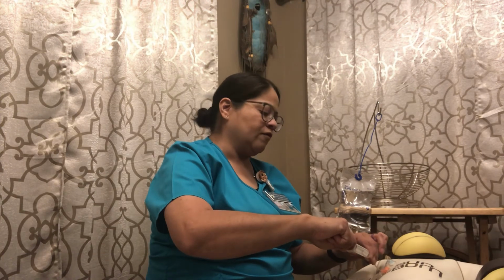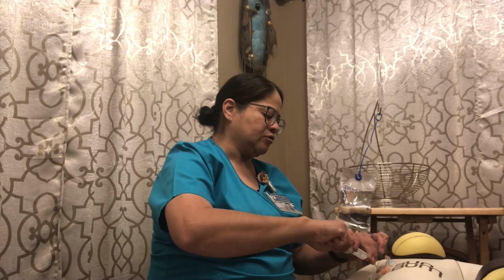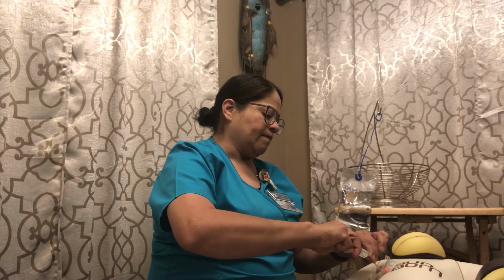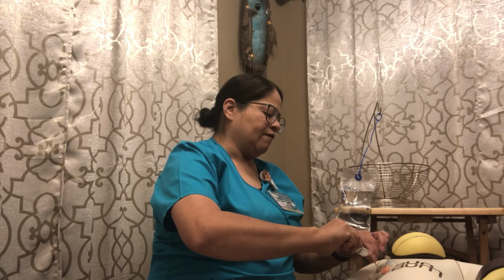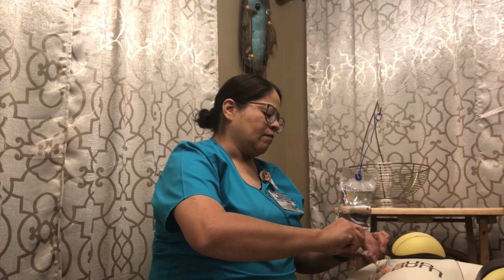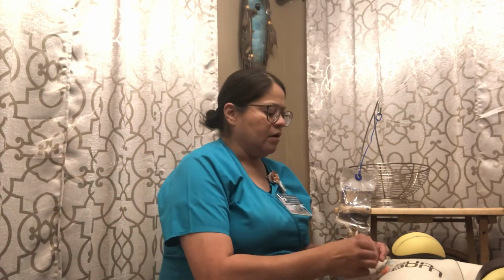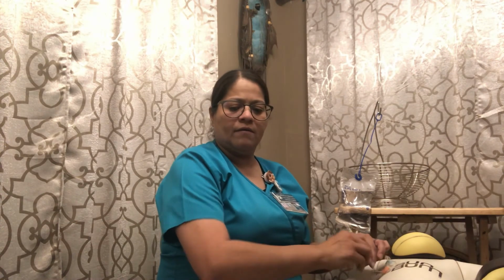There's some blood return. You don't want the blood going into the flush. So then I'm going to go ahead and flush with 10 mLs. So I went ahead and flushed it. Are you feeling okay? Good. So then clean my port again.